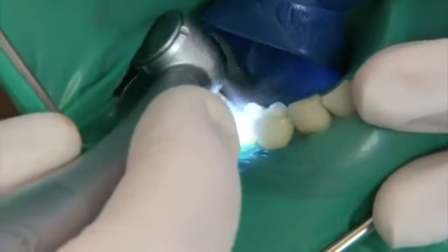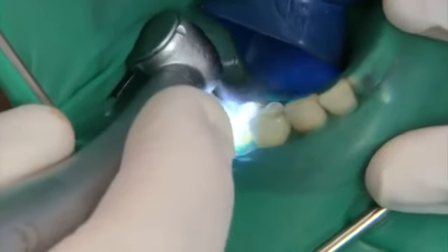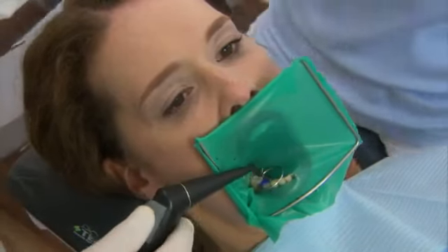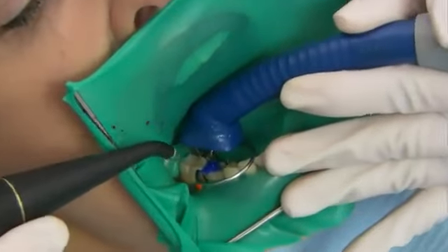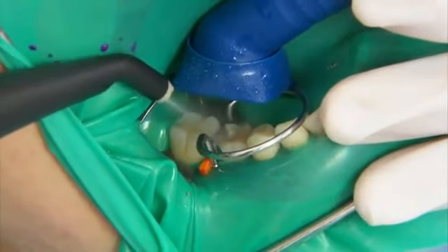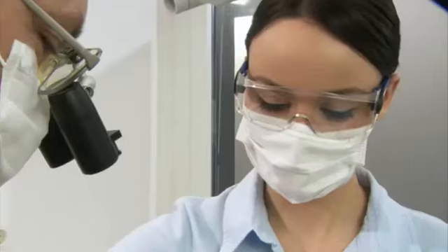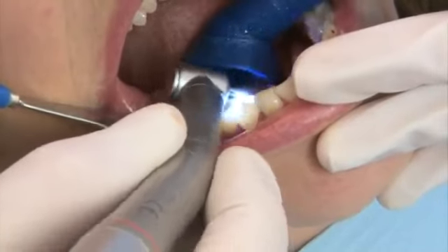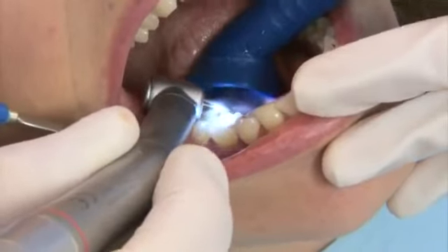The rubber dam technique results in a higher degree of suction comfort. A well-positioned prophylaxis cannula completely removes the rinsed etching gel and aerosol, ensuring the etching gel does not reach the healthy hard tooth tissue. During polishing, excess filler material and aerosol are aspirated by the prophylaxis cannula and prevented from spraying out from the polishing head.